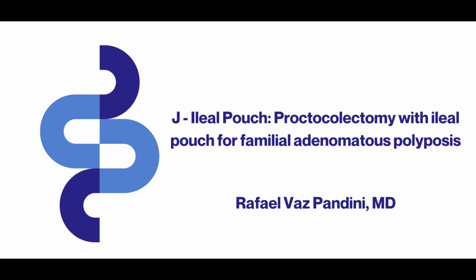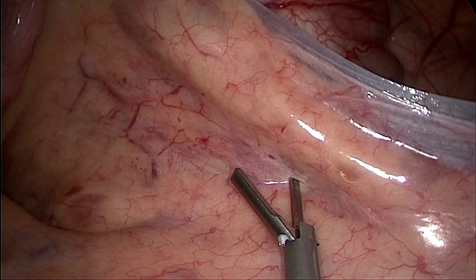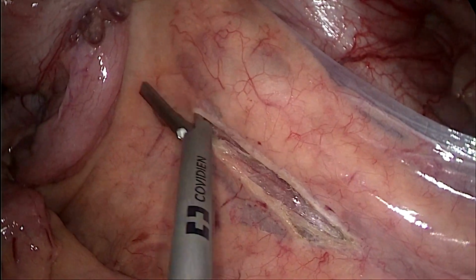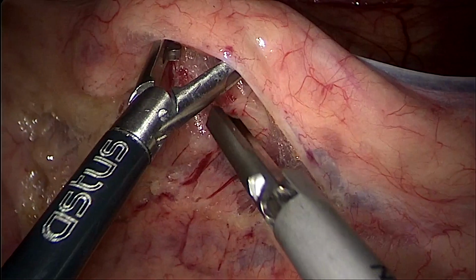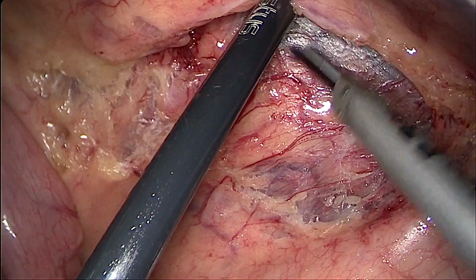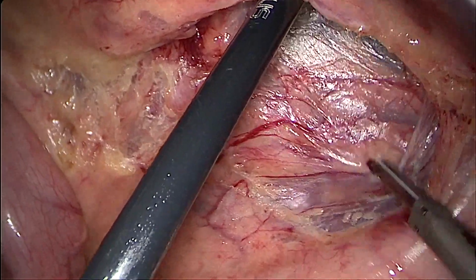Hello everyone. So in this video we're going to show you an ileal pouch for familial adenomatous polyposis. This is a young male patient with a low BMI. We started the dissection knowing we are going to perform a total colectomy or a proctocolectomy.